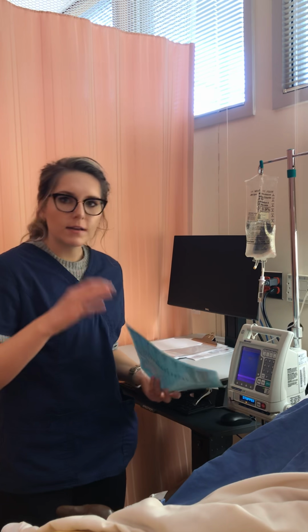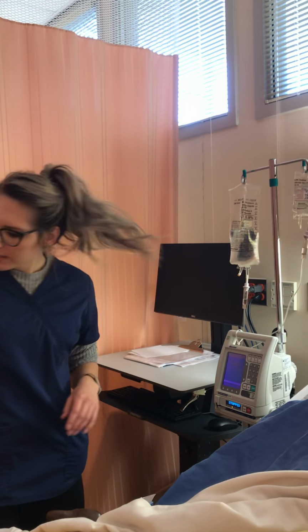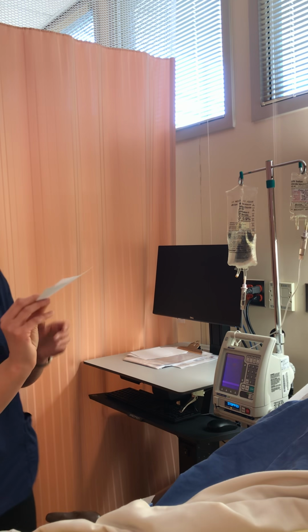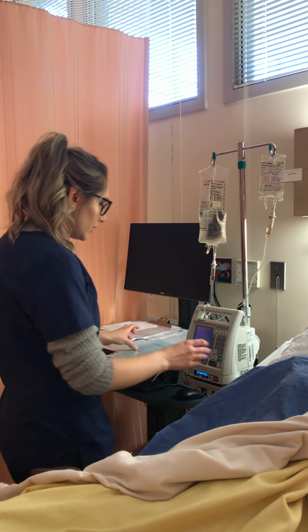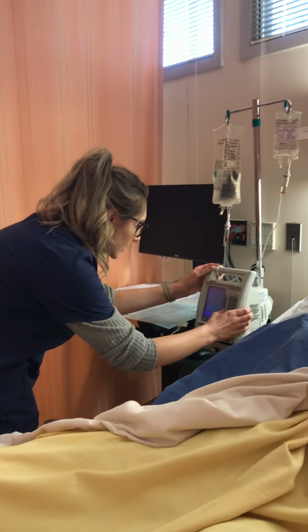Okay, so now that I've done my first check, I'm going to set up the pump here. So I've already done my calculation through Guardian, so I have the 2 mLs per hour, and I'd also like to note that I have no ports on anything here. So I'm just going to go into Guardian, and I'm going to choose insulin.